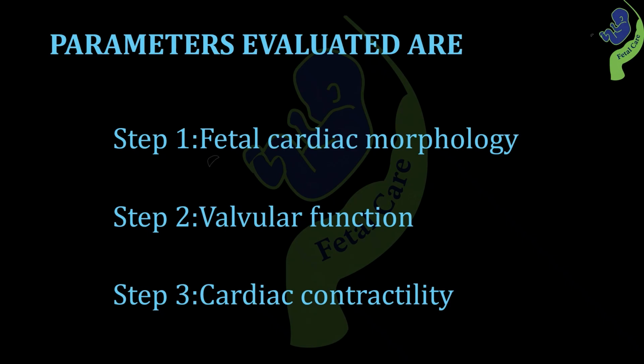Second step is the assessment of valvular function. Here we will be looking at atrioventricular valves and semilunar valves. We will be assessing the diameter, flow patterns, and also will be checking for presence or absence of regurgitation. The third step would be to look for cardiac contractility, that is how well the heart is actually pumping. So together these 3 steps will make us move from purely anatomical view of fetal heart to a functional one.